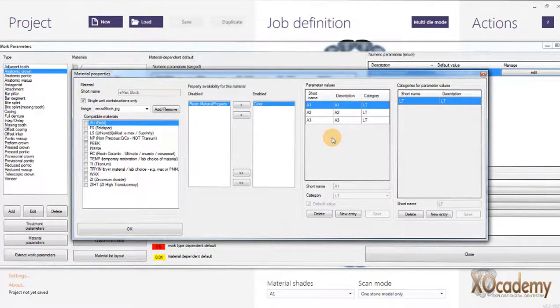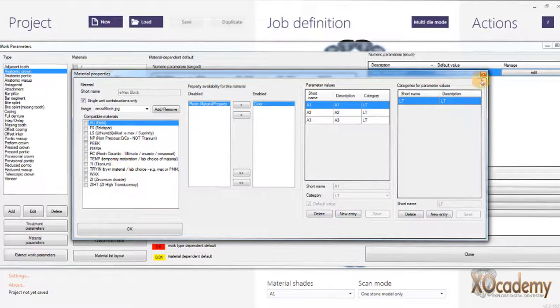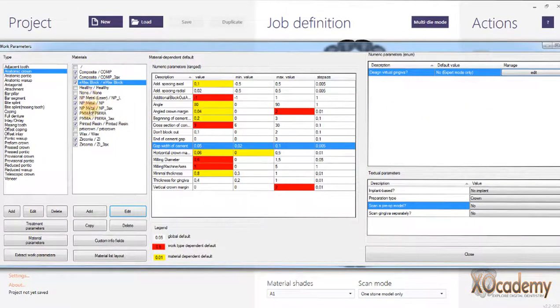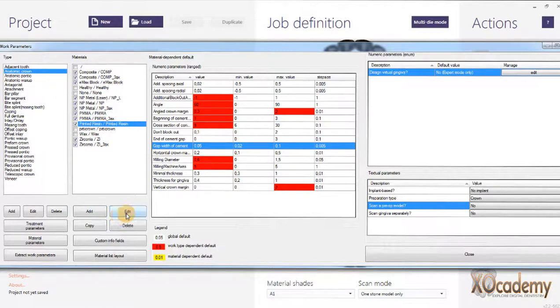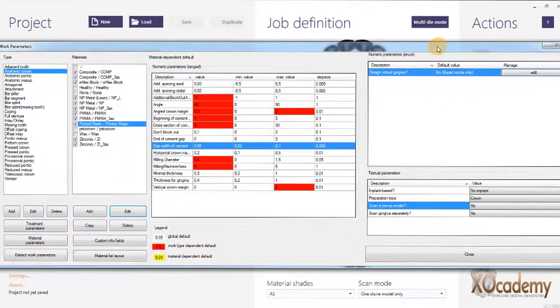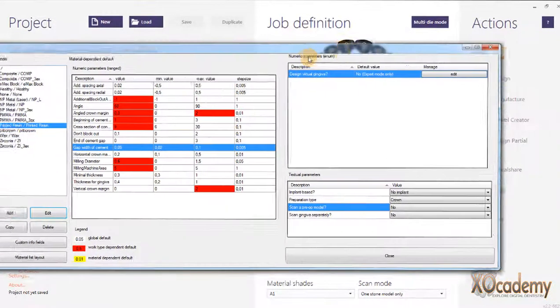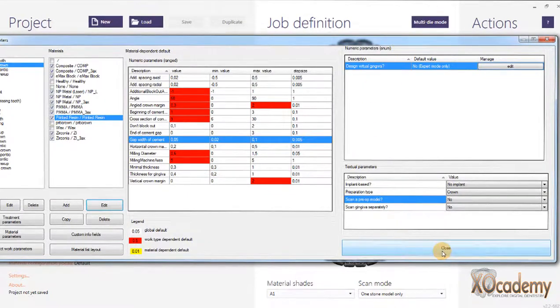It doesn't matter for ExoCad, but it helps when I'm going to actually mill the material to know what shade I've picked. For printed resin I have Dental LT Gray V2 model resin, so that gives me a heads up on what I want to print the restoration out of if I'm doing models or splints or something. That's how you add materials.